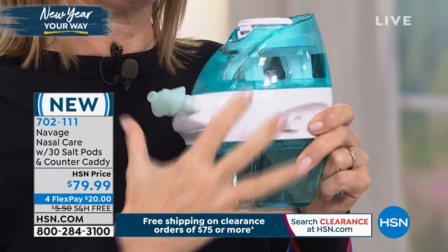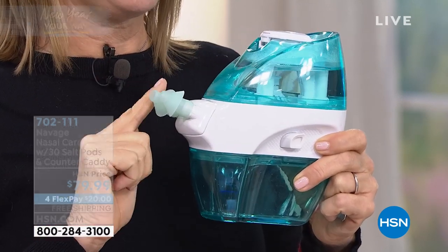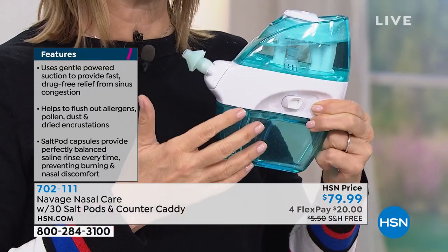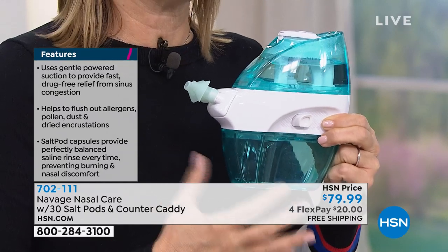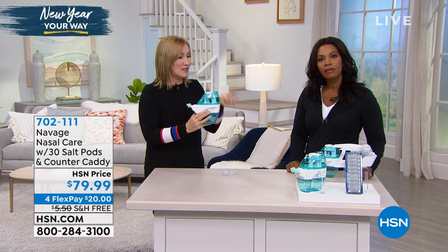When I saw the Navage, I was so impressed because it's handheld and completely clean. The water goes from the top tank through the docking station into the sinuses on one side and out the other — and all the funk, the gunk, the nasties, the stuff you don't want to keep inside your body gets cleaned out. A Kleenex doesn't do it. It's the same reason you vacuum your carpet instead of just sweeping it — you want to really get in there.